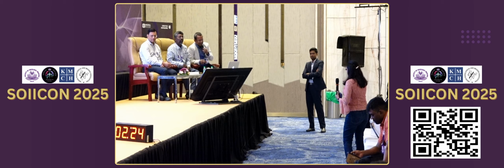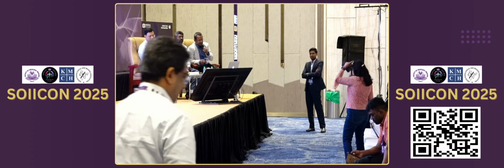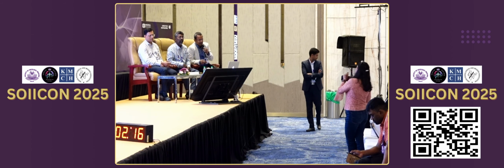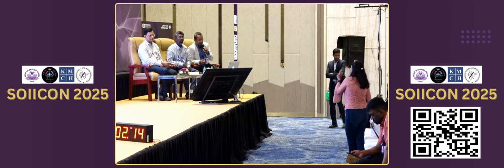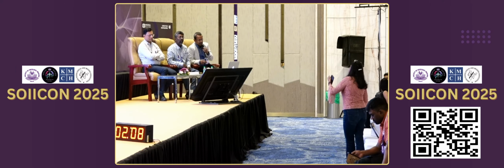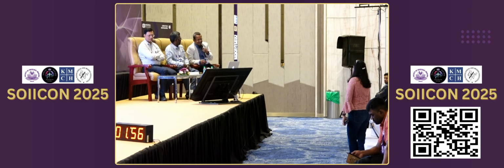So the issue is that the node is also positive on PET, but it still doesn't come under the size criteria. Sometimes the size does not match, sometimes the SUV does not match, because in the bladder SUV is taken as a delayed SUV, not an immediate SUV. So that's what I'm trying to ask: how do you handle those gray areas?